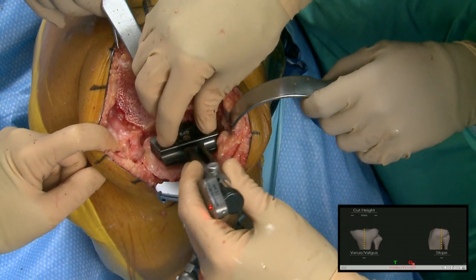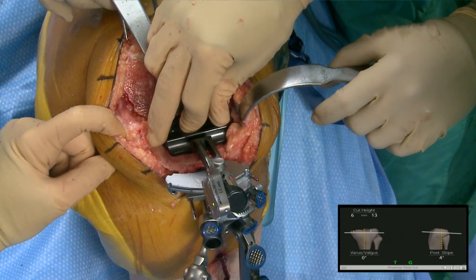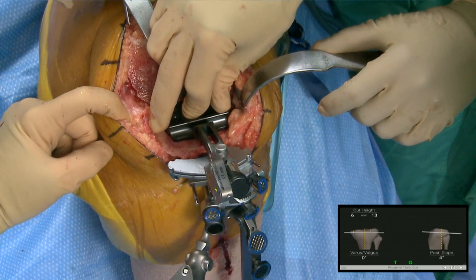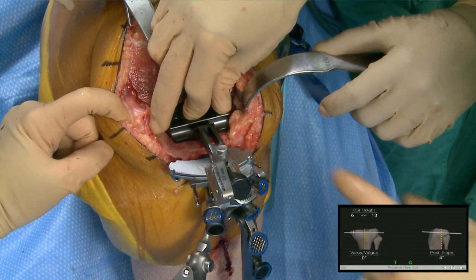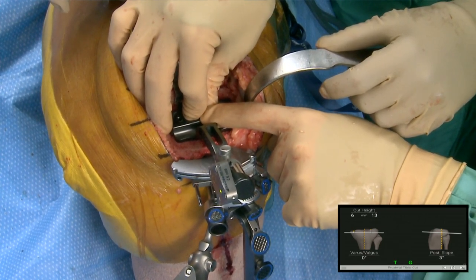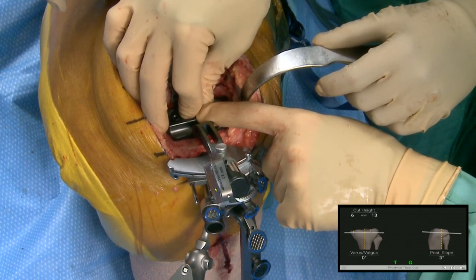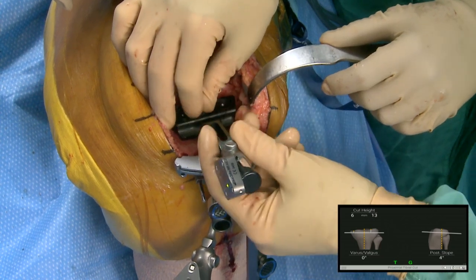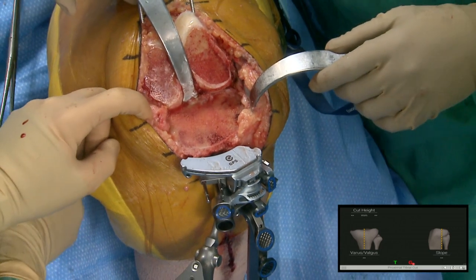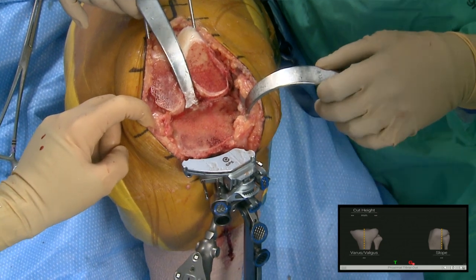One nice thing about this system is we're not putting any pins in the diaphysis — not that what was done yesterday is a tragedy, but we are getting navigation within the wound without extra pins. This is our verification: three to four degrees of slope — maybe three and a half — zero on the mechanical axis. We've cut nine off the lateral side and about two off the medial side. We'll take the guide off.